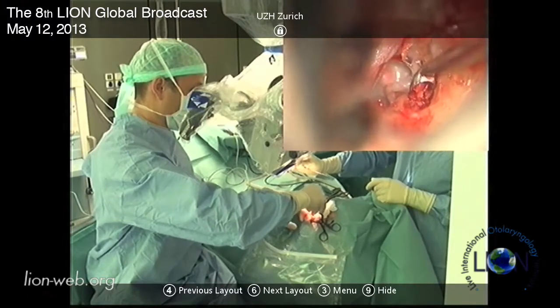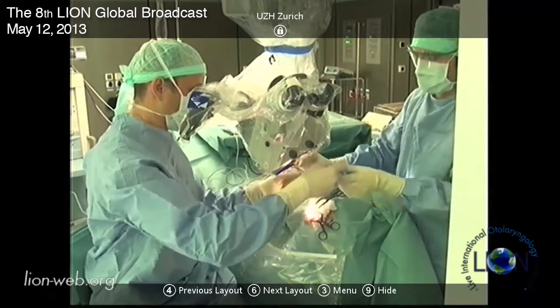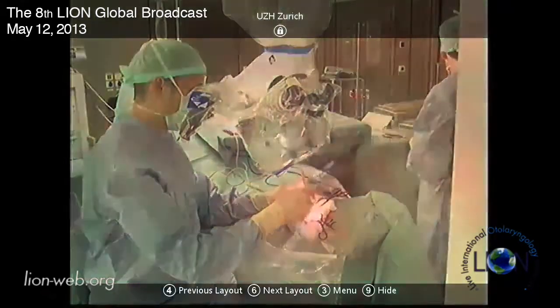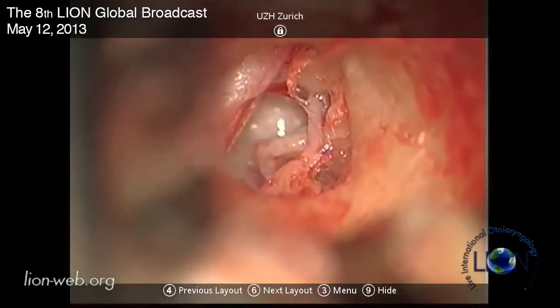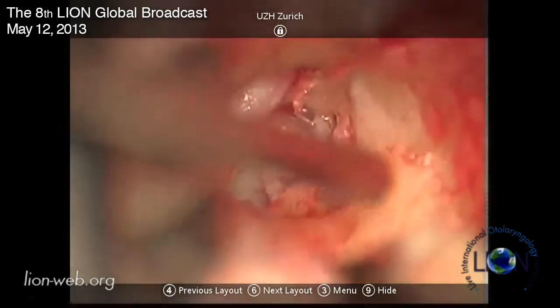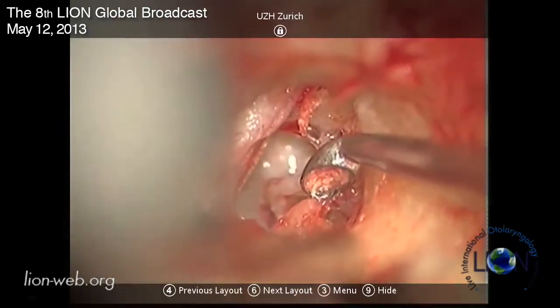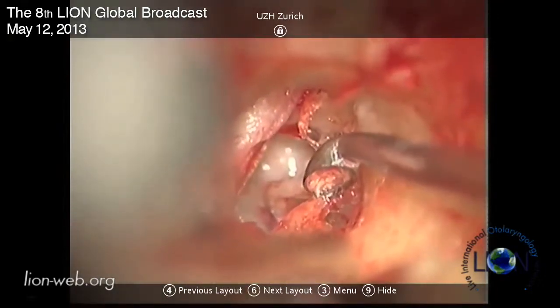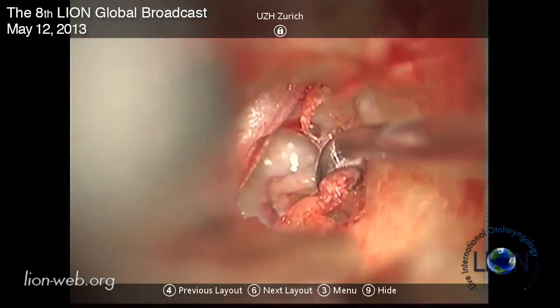I noticed Alex you have a ceiling-mounted microscope, which is very good. It's not ceiling-mounted - it's a Pentero, it's just on a big boom. And now here it's not quite clear where it goes through and we have to be careful.